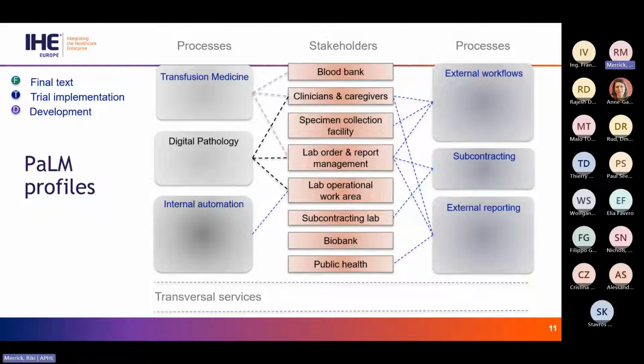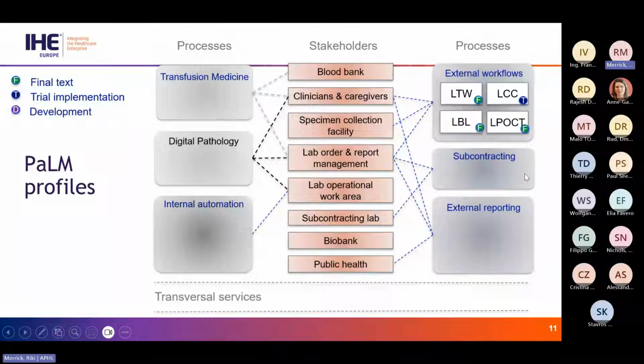And so here are the specific profiles. So we have the external workflow profiles that deal with laboratory testing workflow, and anything that's marked with an F is in final text, and T is trial implementation, and D is under development. So the laboratory testing workflow is the exchange of lab orders and results between two laboratories.